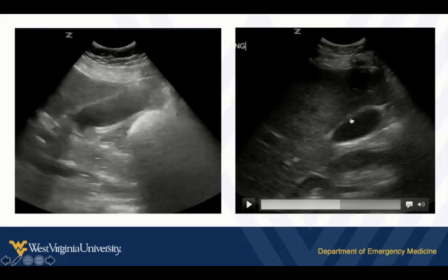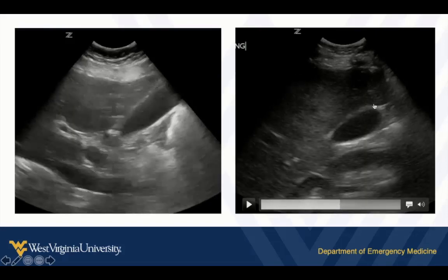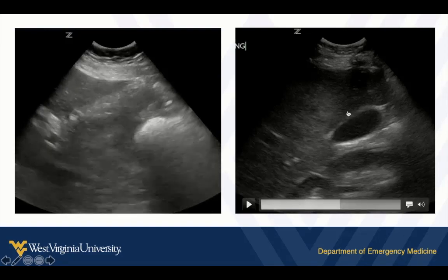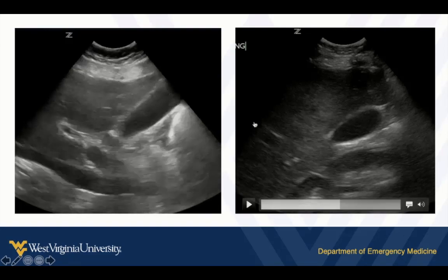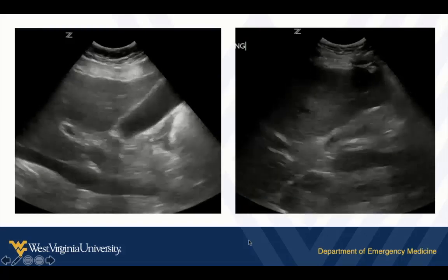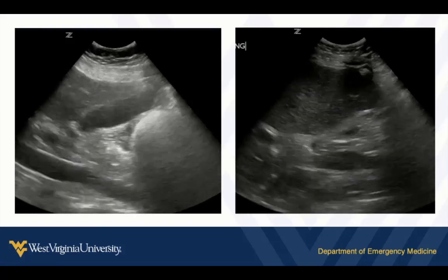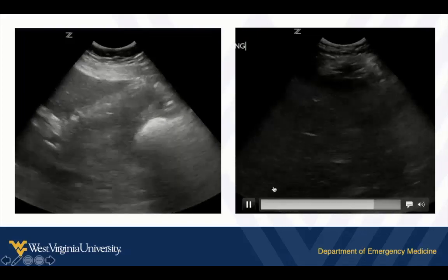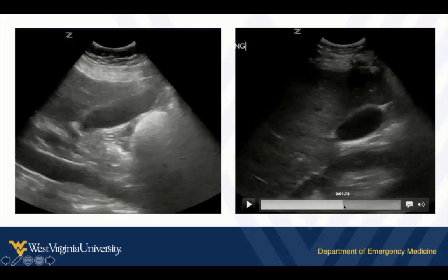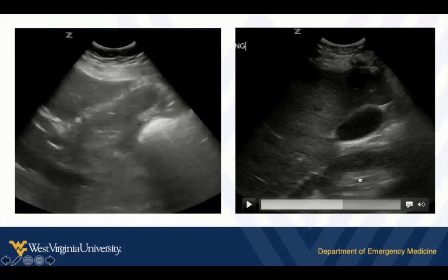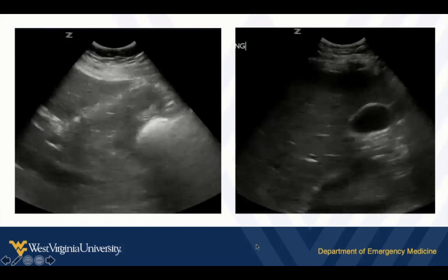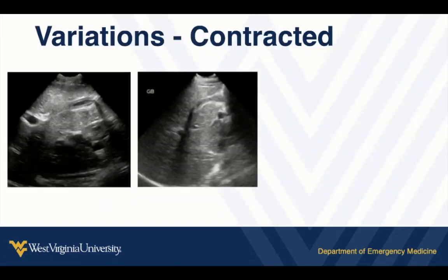Fanning through, we identify the neck and all the way up to the fundus. Notice it has a nice, crisp, well-defined, bright white wall — that's the sign of a non-inflamed gallbladder. There's no fluid around it. The wall is nice and crisp and well-defined. We see our other landmarks to confirm we're identifying the right structure, and depending on the slice, we may also see the right kidney in our view.